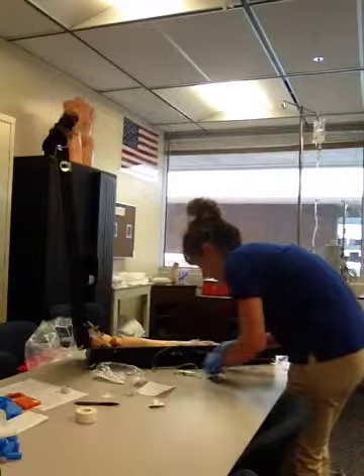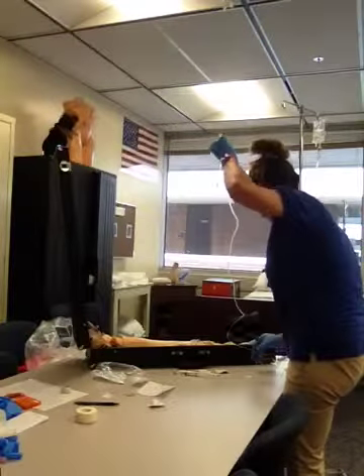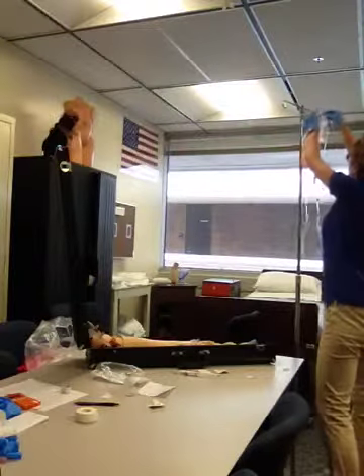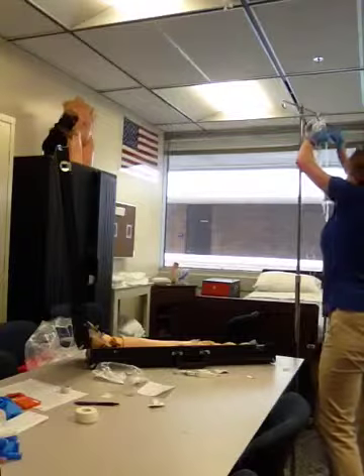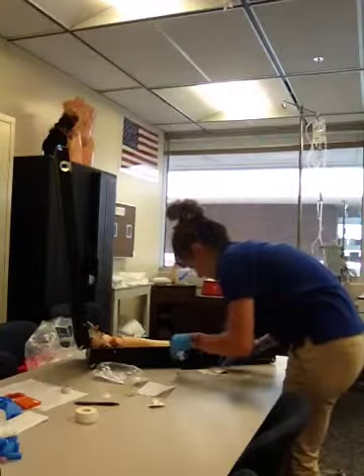I'm going to disconnect the main line. And I would put on a new alligator clip and hang the line for future use. And then I would clean the port.